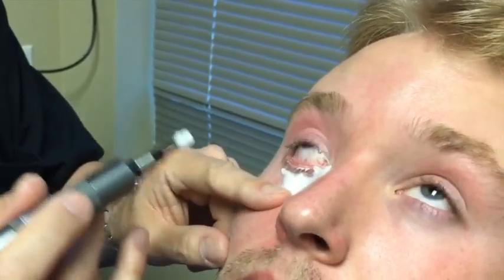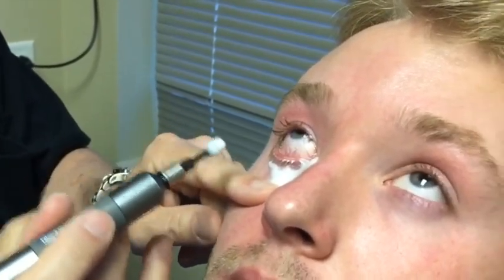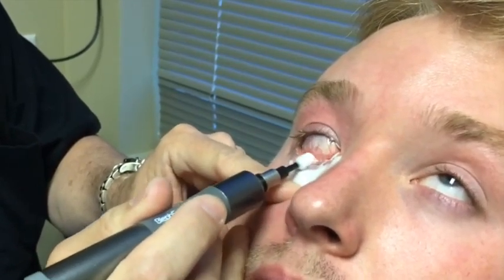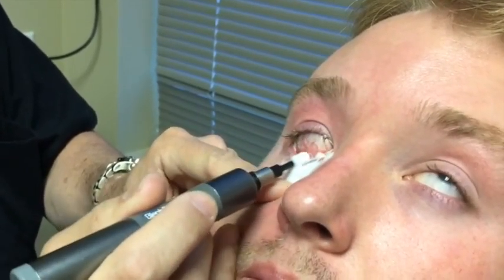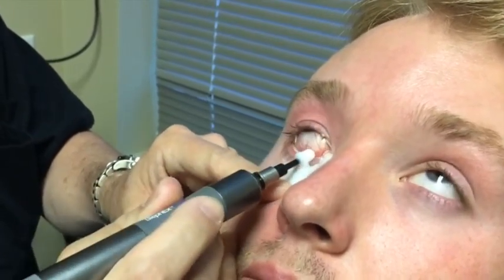And see how instantly the patient begins reacting? Because a light treatment is much more uncomfortable. It's actually very ticklish. So you want to come in very firmly and push hard. It makes the treatment more comfortable and makes it much more effective. After 30 seconds or so, I'm going to reverse the spin.